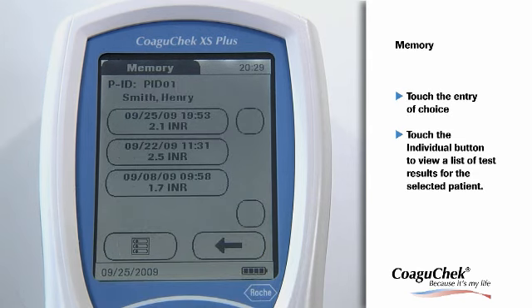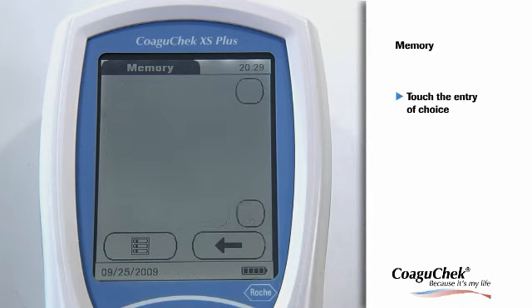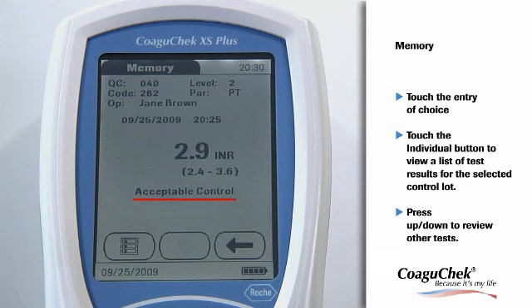When you press the Individual button, a list of results for the selected patient is displayed. Date and time are also shown, so you can be confident that your therapy can be optimally geared towards your patient's needs. From the quality control result list, touch the entry you want to review. You can also see other info displayed, such as QC ID, operator ID, parameter tested, QC level, as well as time and date. Additionally, up to three comments are available below for each result.